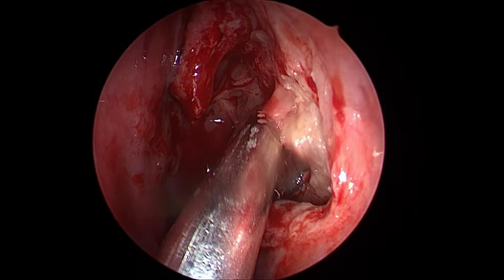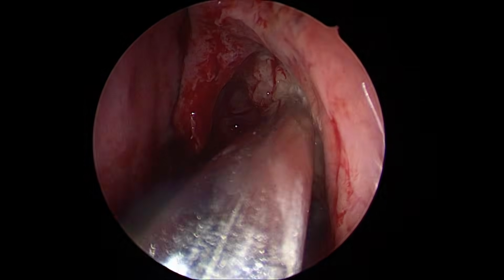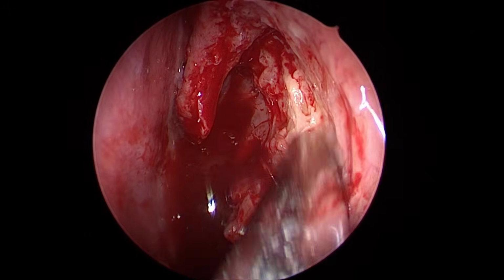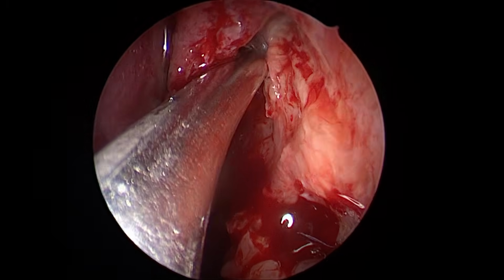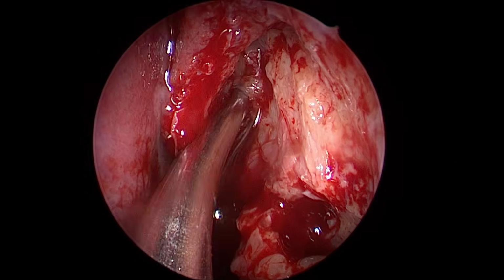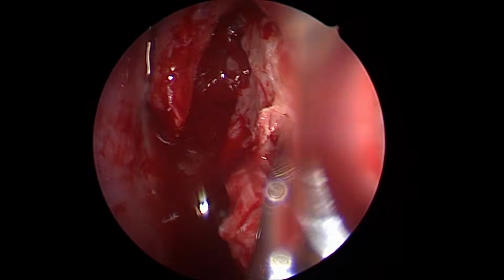Now, once you remove the upper part of the uncinate, the first important landmark I look for, see this? That is the lamina papyracea. Your lateral limit of the entire paranasal sinus corridor comes in your way. Visualize this lamina. The moment you remove the upper part of the uncinate, you come closest to the lamina.